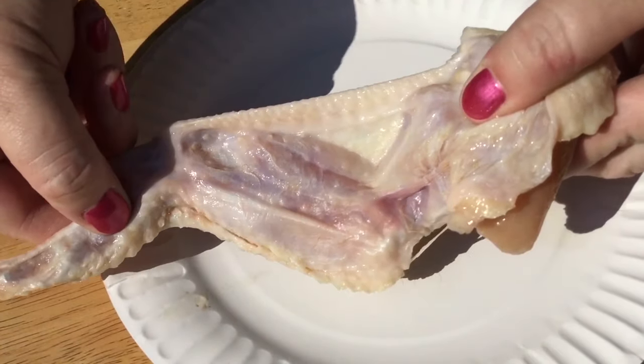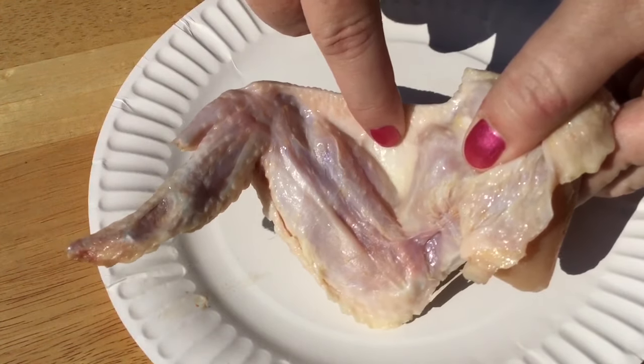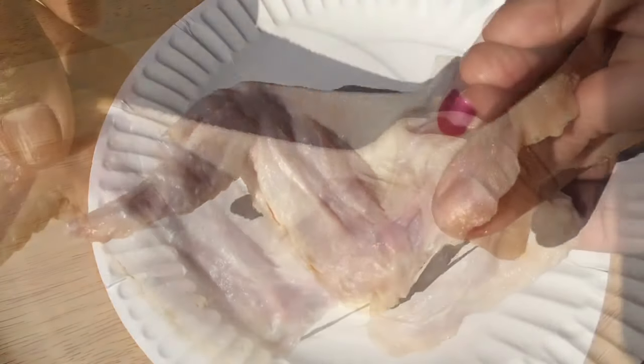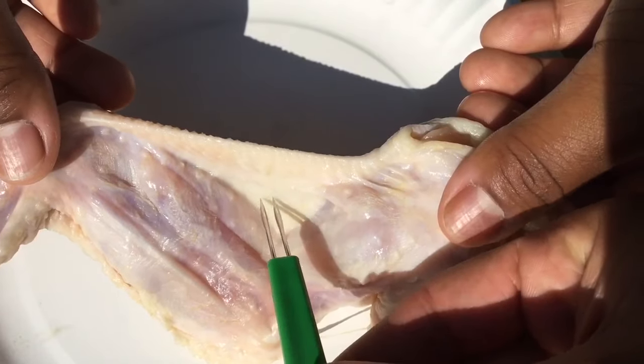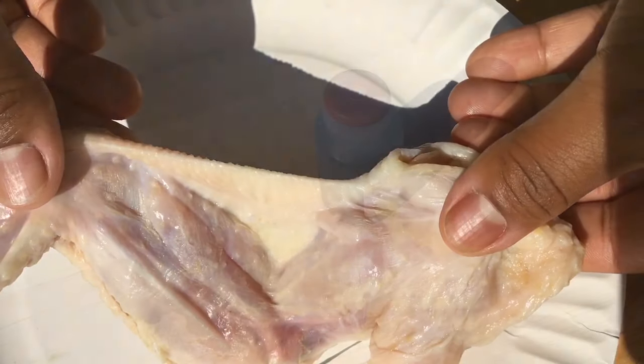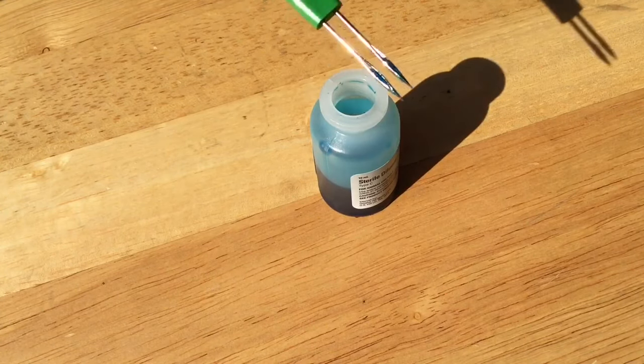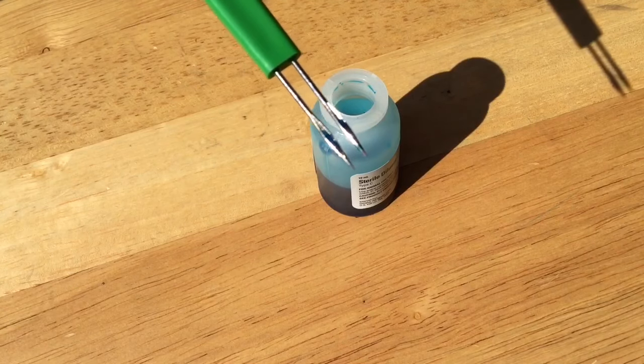You will be vaccinating your chickens in the portion of the wing called the wing web. It is the thin part located here. You can practice on a store-bought chicken wing, being sure to press all the way through the wing web. When you dip the applicator stick into the vaccine bottle and pull it out, you'll see that the grooves are filled with the vaccine.